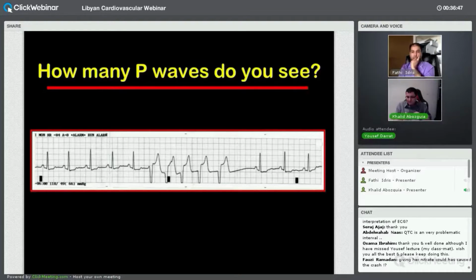So what I recommend, and I agree with Khalid, is just don't look at it. Interpret the EKG first with your basic knowledge, looking at the P wave, the PR interval, the QRS morphology, and then after you have made up your initial interpretation, you can further verify by looking at the report. But if you go to the report first, you'll be misguided. That's my advice. I agree.